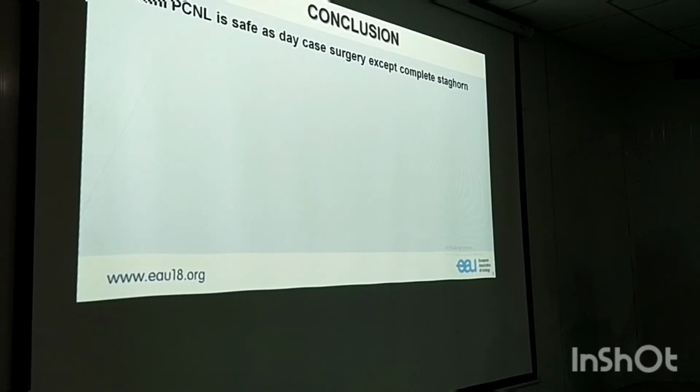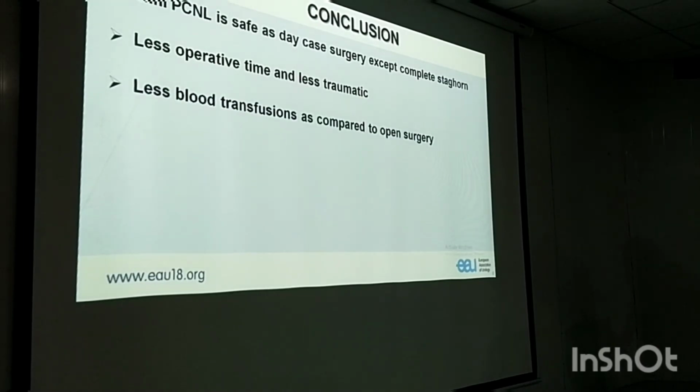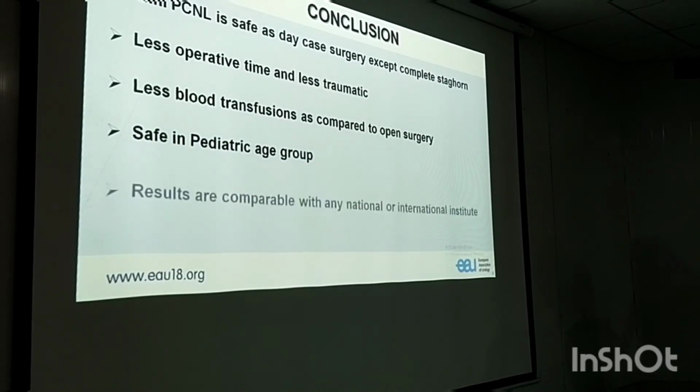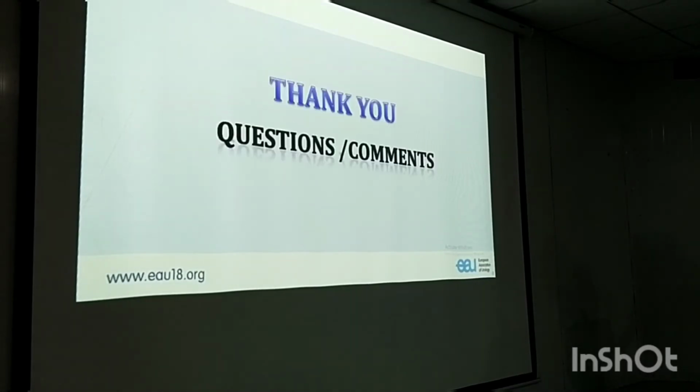Mini-PCNL is safe as day case surgery except for complete staghorn stone. Then less operative time, less traumatic, less blood transfusion as compared to open surgery, and safe in the pediatric age group obviously. Then results are comparable with any national or international institute. Clavien 4 and 5 complications are very rare in PCNL settings. Thank you, and your questions are welcome.